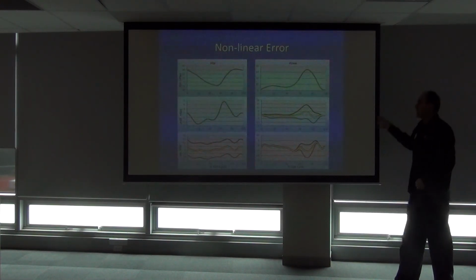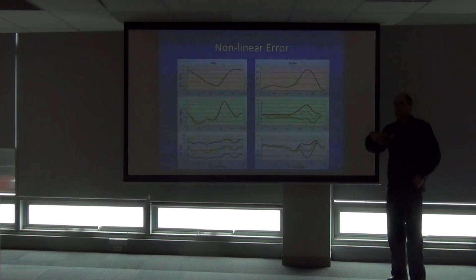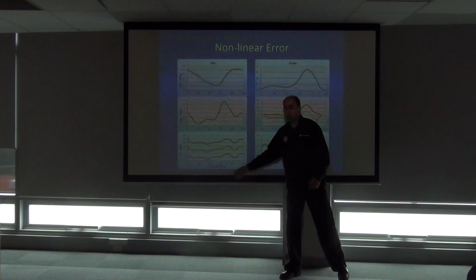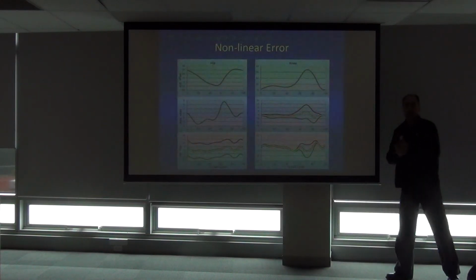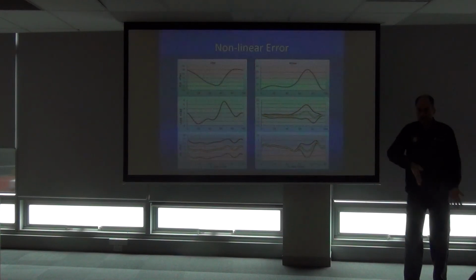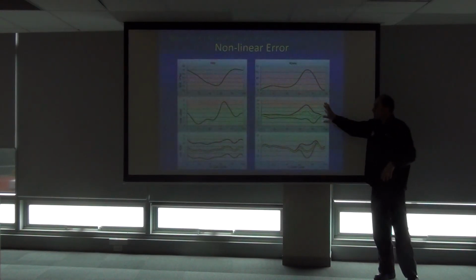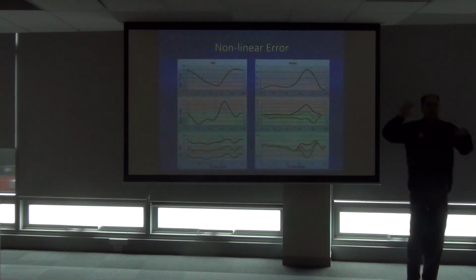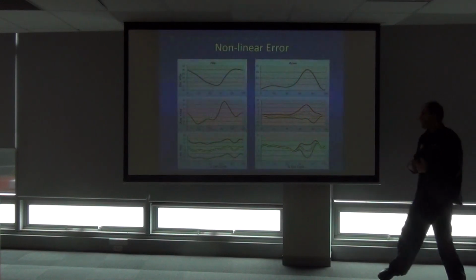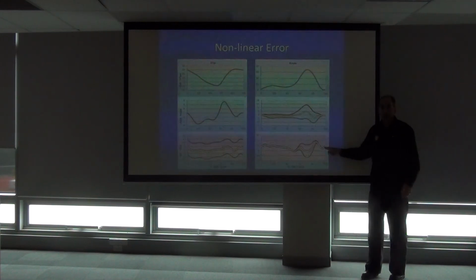So the next thing to do, we knew the error that we put in. We have that equation that we went through before. We put in the correction, the negatives. So instead of plus 10, we put in minus 10. Instead of minus 10, we put in plus 10 to the respective data. This is after it's calculated. We're not going back to the static and aligning our axes back up again and recalculating. We're just working with the calculated joint rotation data that has error in it, and applying the correction. When you apply the correction, we're back here where we should be.